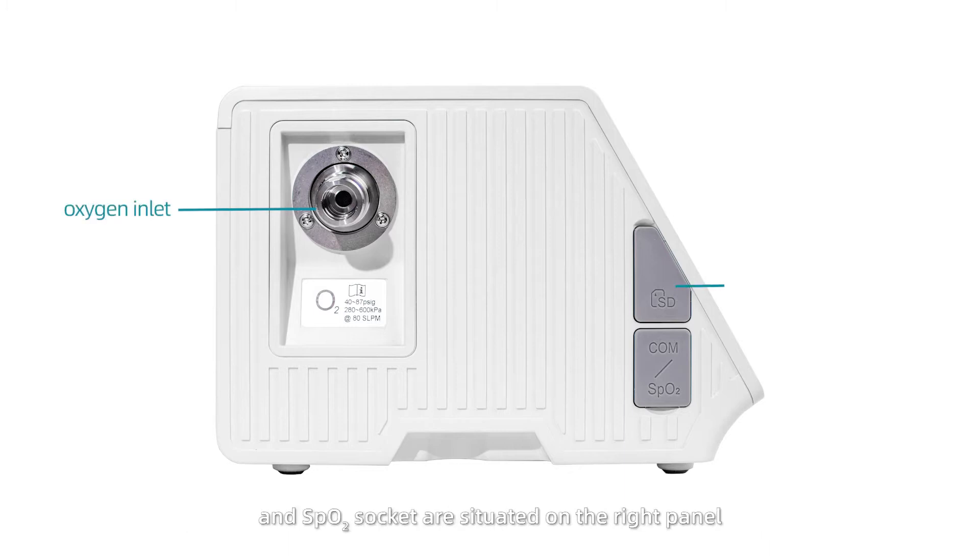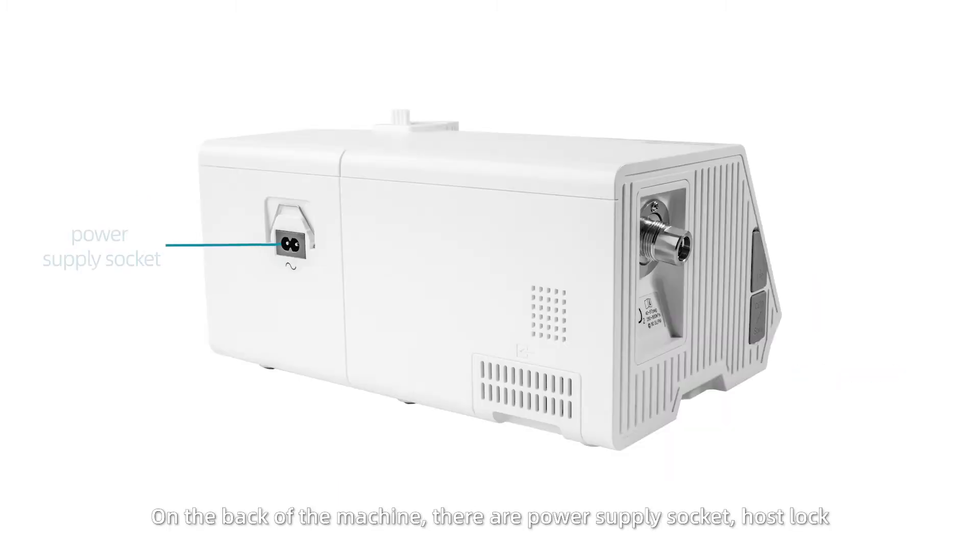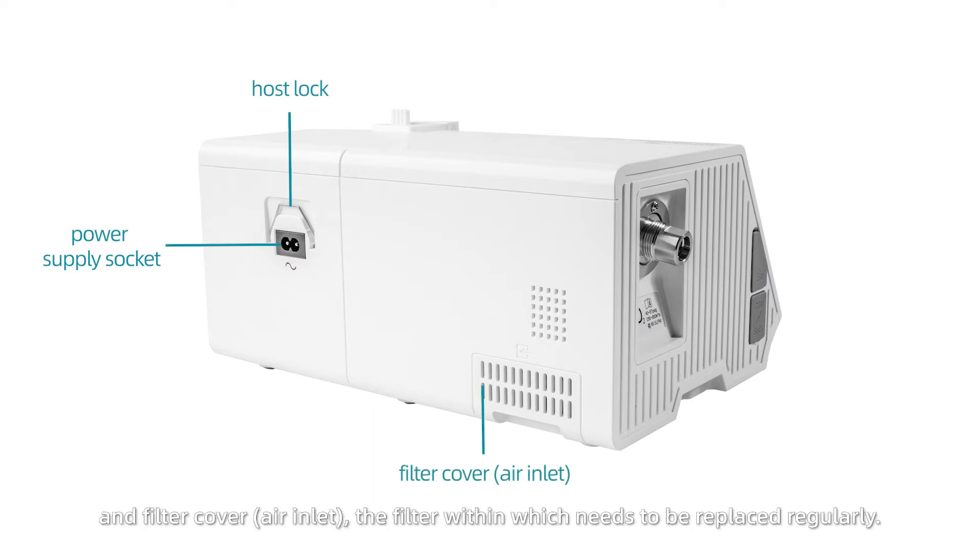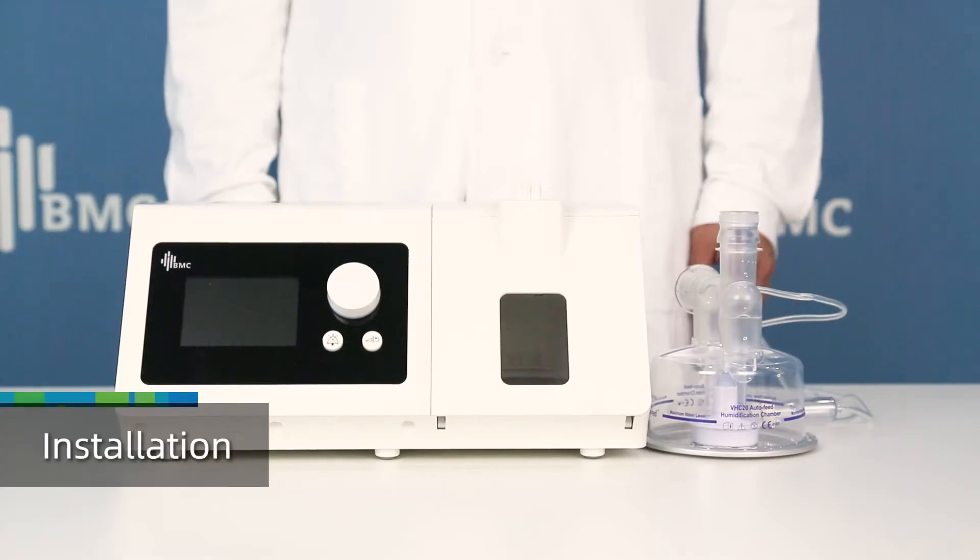On the back of the machine, there are a power supply socket, host lock, and a filter cover. The filter within needs to be replaced regularly. Installation: Open the water chamber cover.